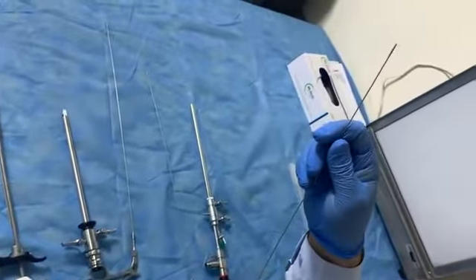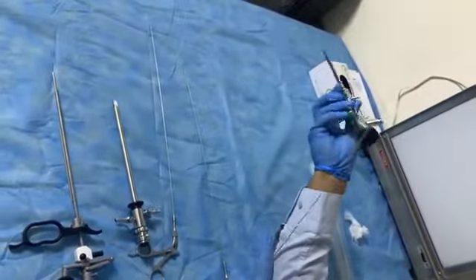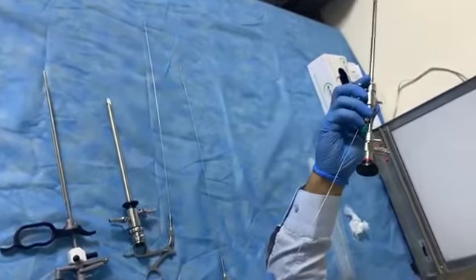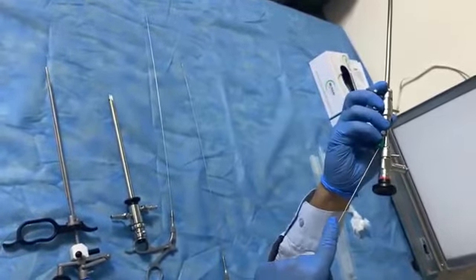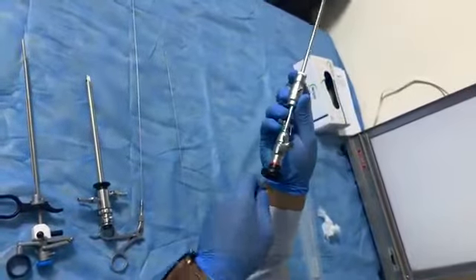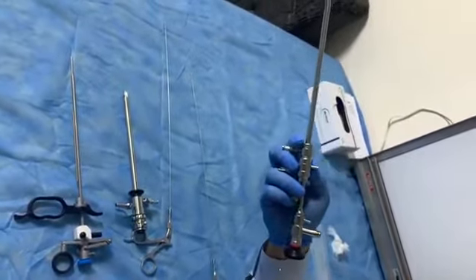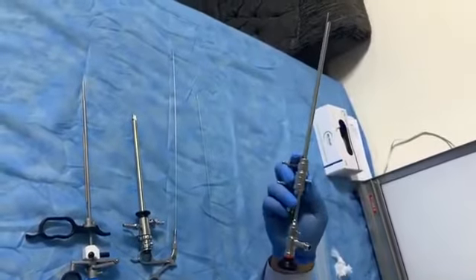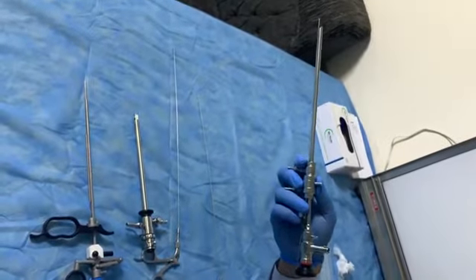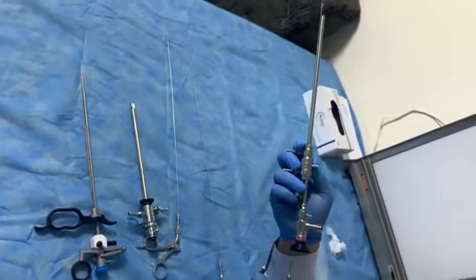This part is the scissors. We push this part from here, through this channel, and slowly watch it here. When there is a septum, we can cut it. When there is fibrous tissue inside the uterus, we can cut it. We can cut it under vision.